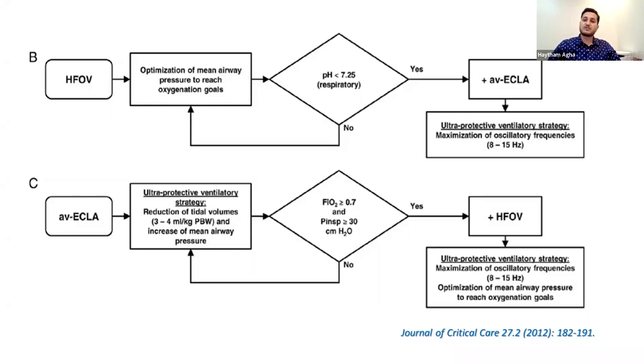So at this point, it's better to put the patient on high frequency mechanical ventilation just to keep the lung patent and protected, because eventually we'll wean the patient from AV ECMO and he will depend on his own lung. If the lung is injured, we find, as we have seen several times, failure of weaning from ECMO because of respiratory issues. So that's why we are using high frequency instead of conventional mechanical ventilation with AV ECMO.